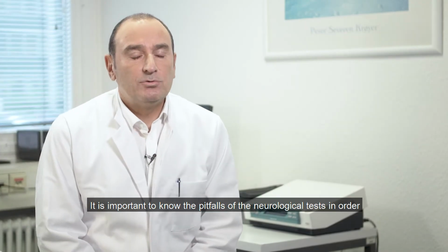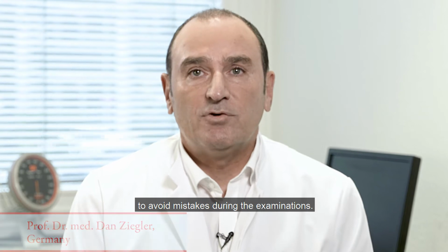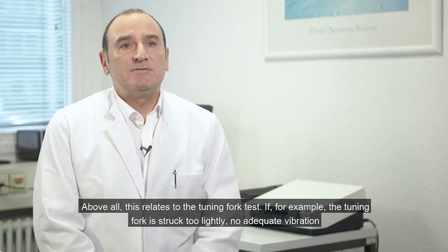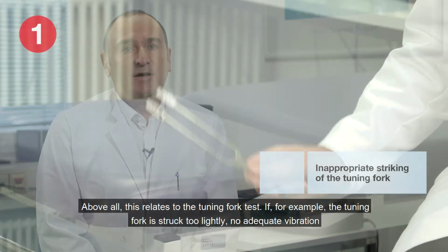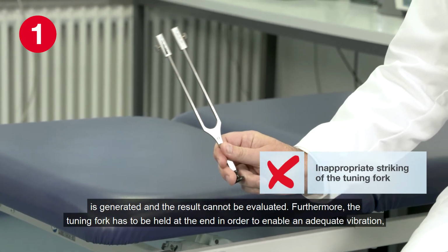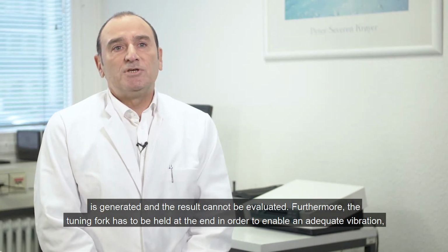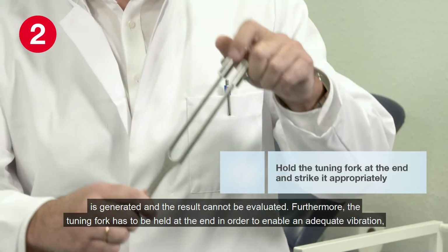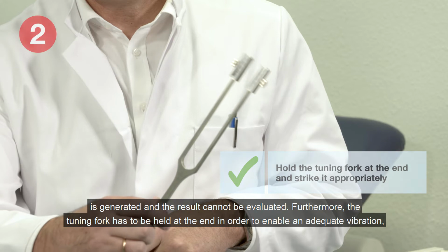It is important to know the pitfalls of the neurological tests in order to avoid mistakes during the examinations. Above all, this relates to the tuning fork test. If, for example, the tuning fork is struck too lightly, no adequate vibration is generated, and the result cannot be evaluated. Furthermore, the tuning fork has to be held at the end in order to enable an adequate vibration.